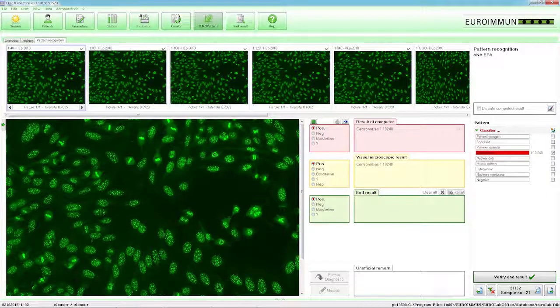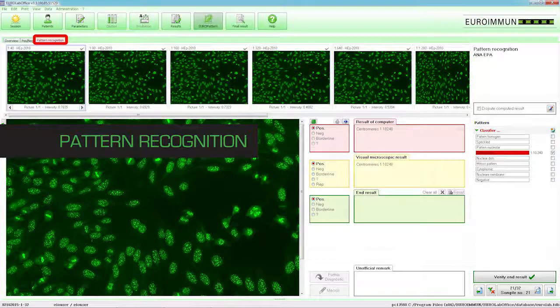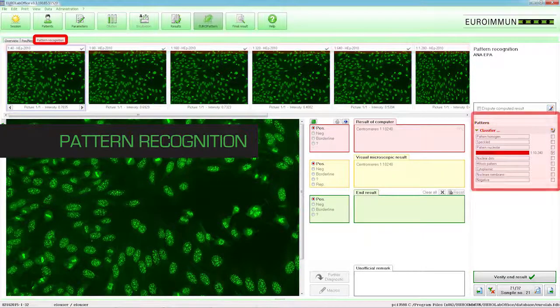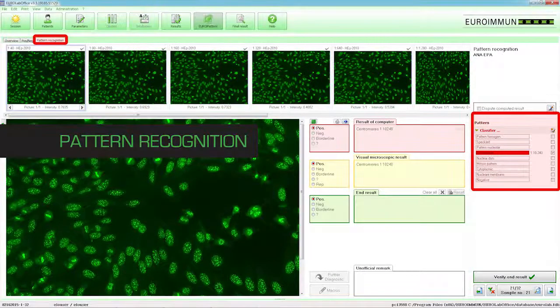Samples in the positive batch are to be viewed in more detail via pattern recognition. Under Pattern Recognition, information about the substrate, dilution, and number of available images is located above each image. All results and titers per patient are displayed on the screen at the same time. Information regarding the fluorescence patterns can be found to the right of the magnified view.